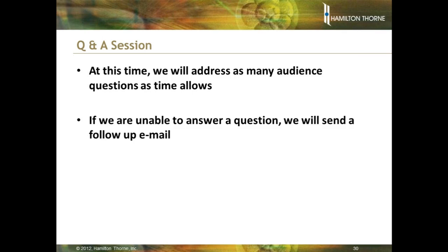I'm going to open the mic to both Dermot and Dr. Behr, and I'm going to start off with this question. I believe this is for Dr. Behr. What size biopsy pipette for blast biopsy, which is expanded and not hatched? I use a smaller internal diameter biopsy pipette for trophectoderm than I do for blastomere.